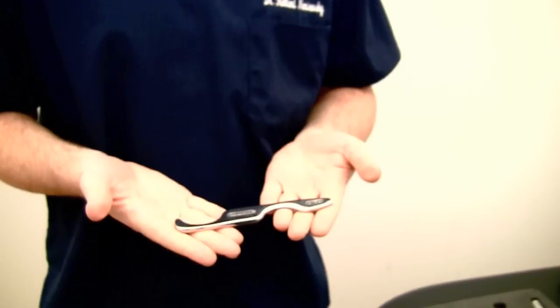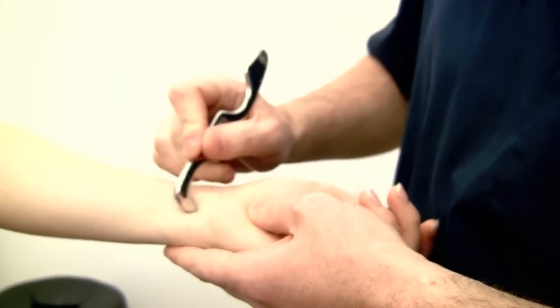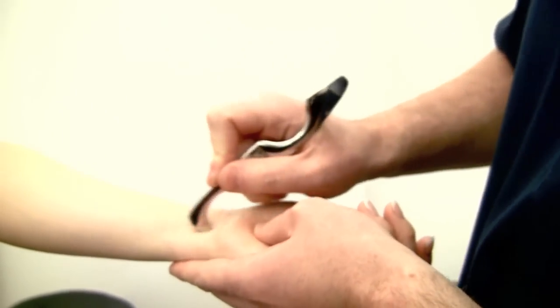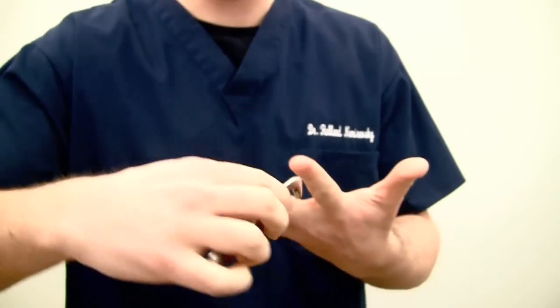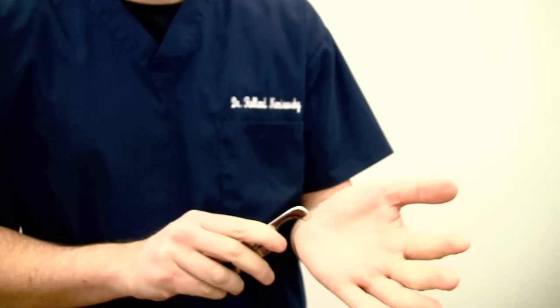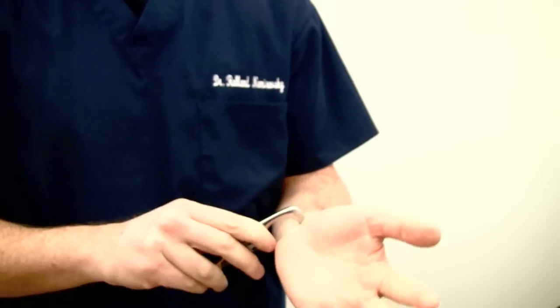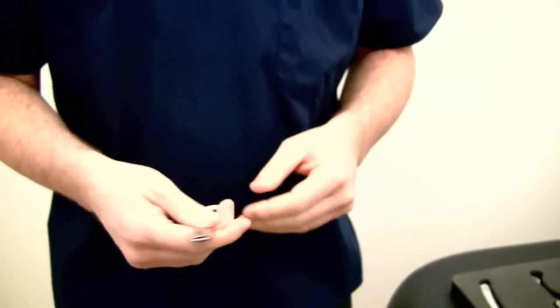This tool is specifically used for smaller areas, specifically around the hand. You could use it for conditions like carpal tunnel. It's really great because it could work the muscles in and around the hand in this direction. This side is really great because you can get in between tendons, and you can get nice and deep inside between the wrist bones that exist right over here. So it's a really great tool if you're going to work small areas.